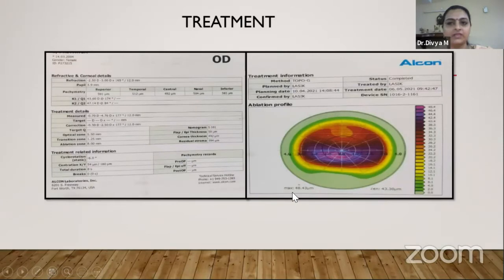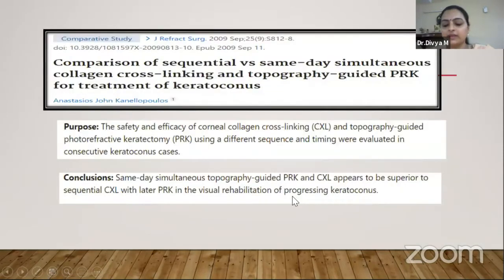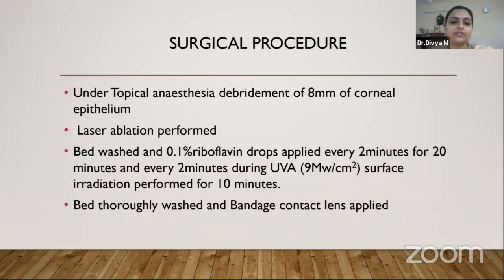So again, coming to the surgical procedure, as we all know, there is debridement of the corneal epithelium for about 8 millimeters. Laser ablation is performed.